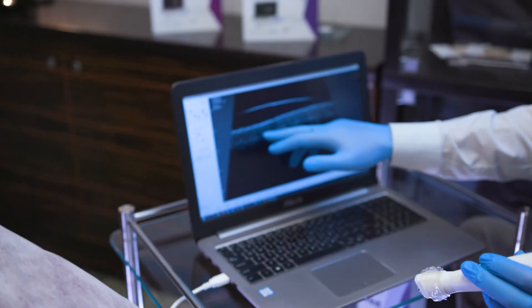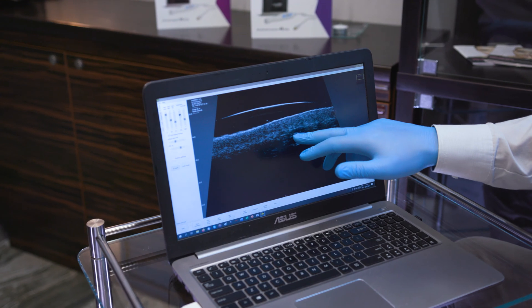Thanks to the high image resolution we can easily see all the skin layers. DERMAMET is dedicated to all professionals from the aesthetic medicine sector, cosmetology, and dermatology.